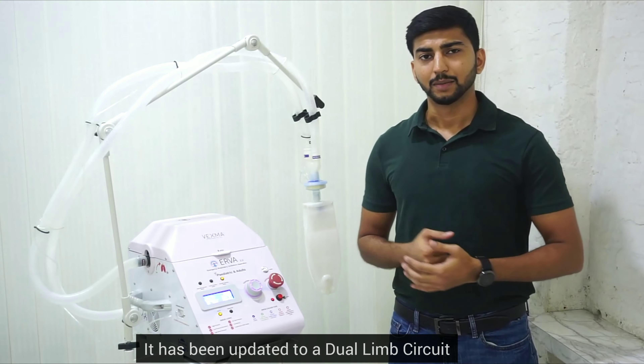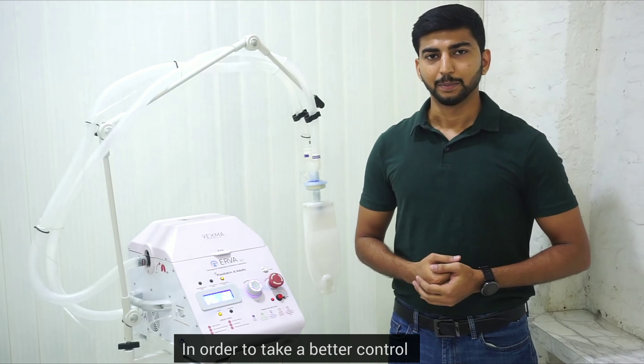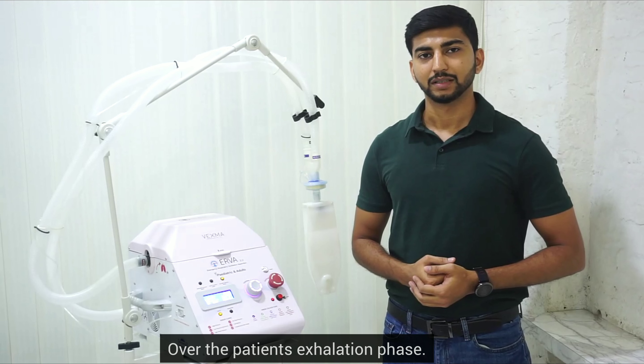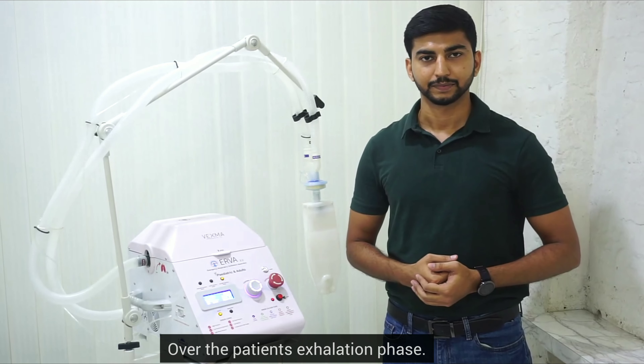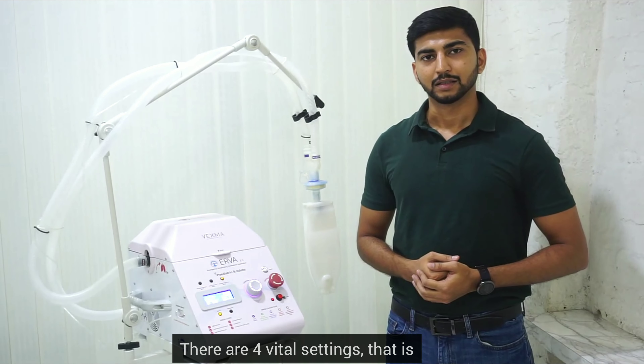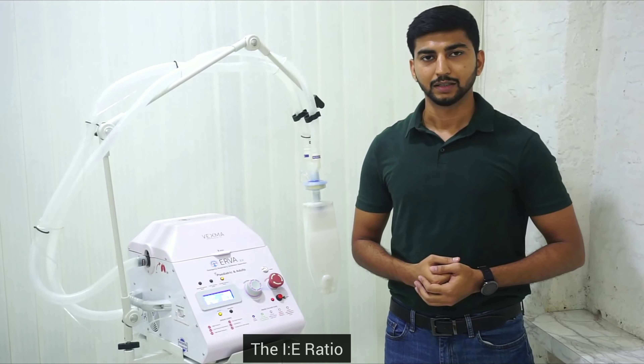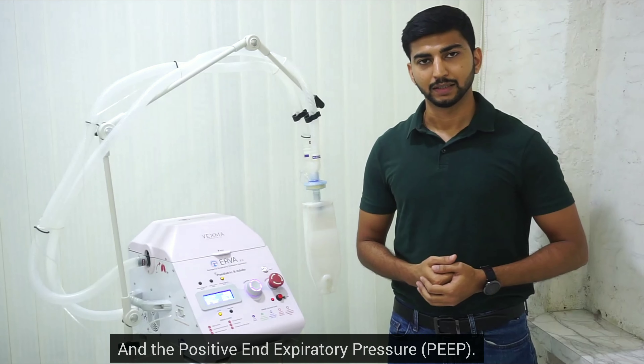It has been updated to a dual limb circuit in order to gain better control over the patient's exhalation phase. There are four vital settings: the respiratory rate, the IE ratio, the tidal volume, and the positive end expiratory pressure.